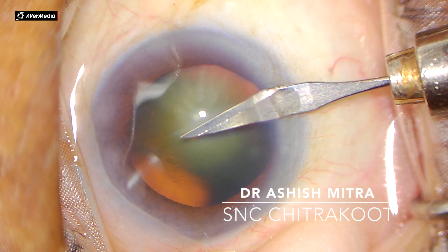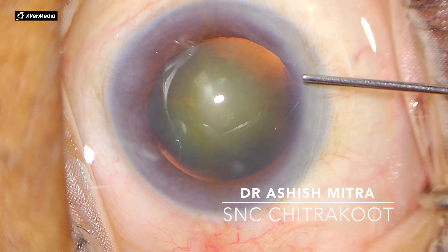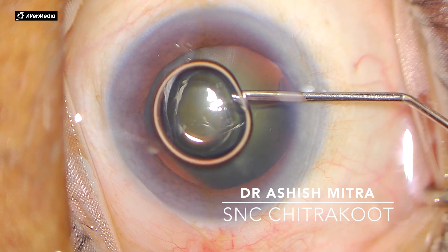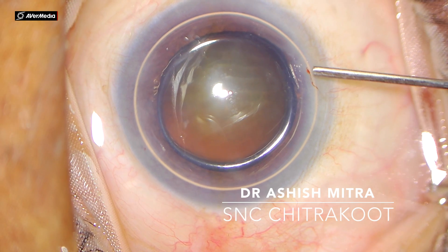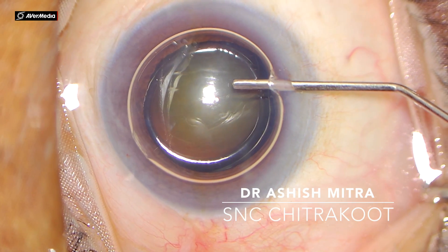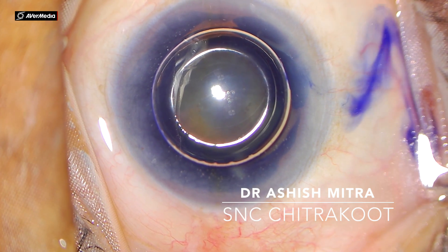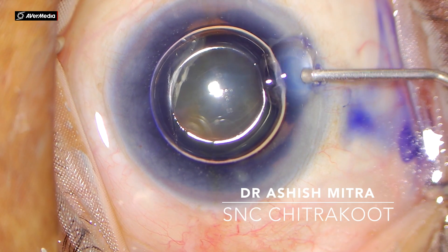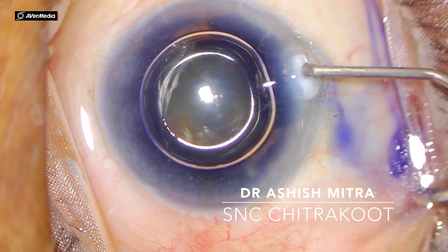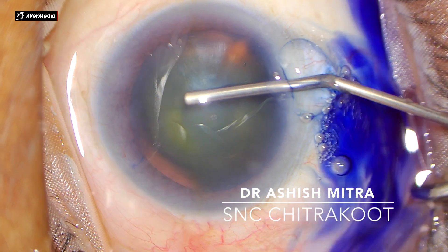After making two side ports, air was injected into the anterior chamber. You should inject a full chamber of air, and after that dye is injected slowly. The air helps to form a dye lake over the capsule which stains it uniformly and protects the corneal endothelium.